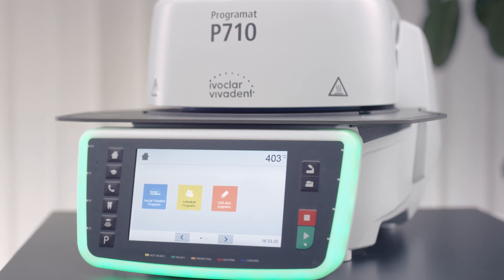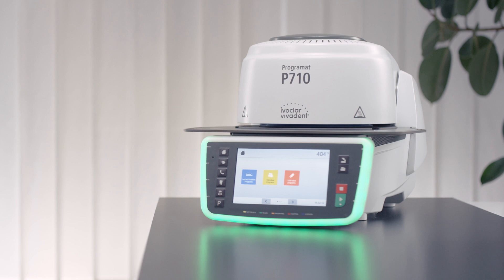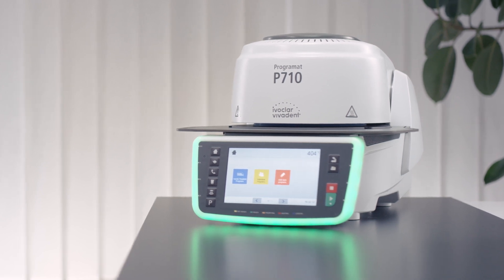The settings may vary depending on the mobile phone being used. For further information, please see the operating instructions of your mobile phone.